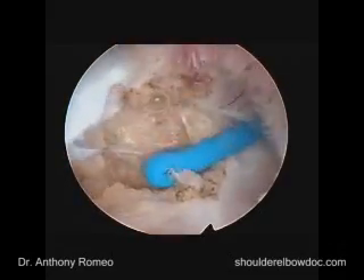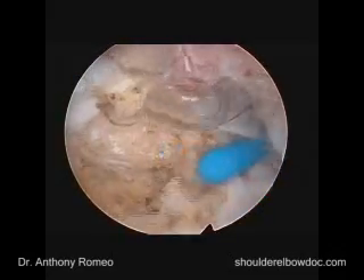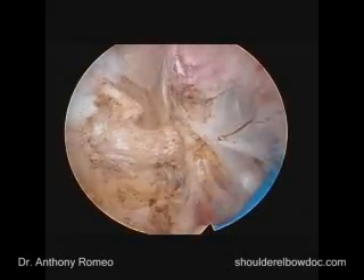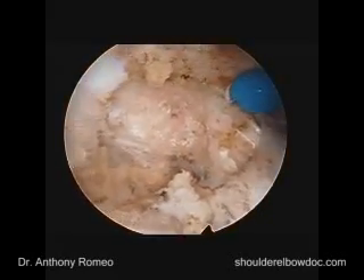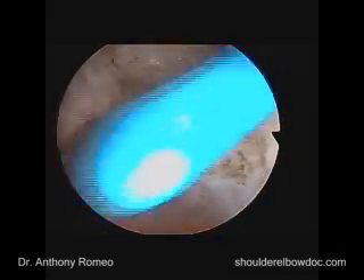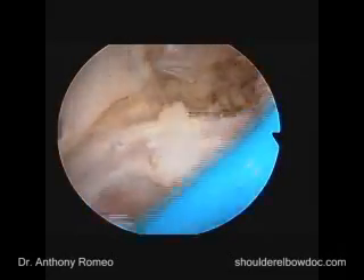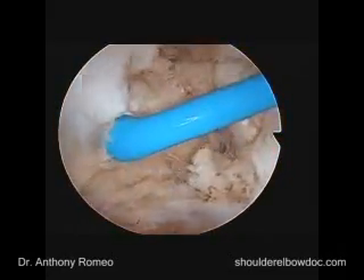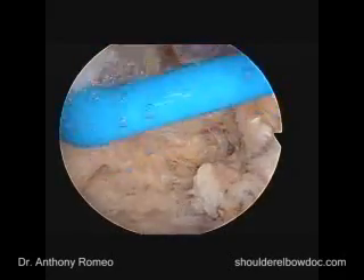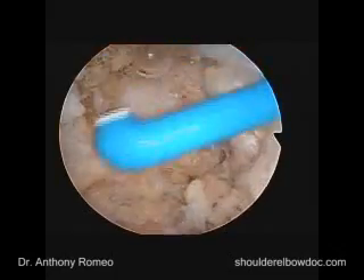In terms of the neurovascular concerns in this area, this is the attachment site of the short head of the biceps and coracobrachialis. The musculocutaneous nerve is going to be about three to five centimeters below that. The axillary nerve is going to be far down in this area. We would have to work very hard and go quite a ways to enter an unsafe zone. Staying just on the backside of the coracoid process, that's not a concern.